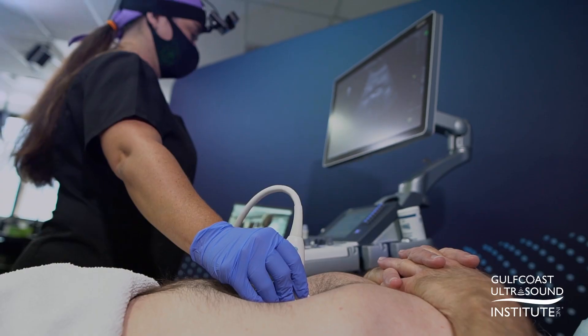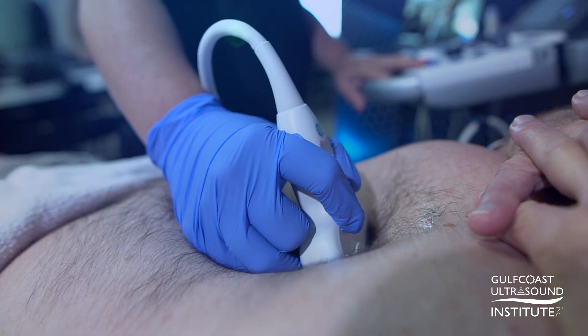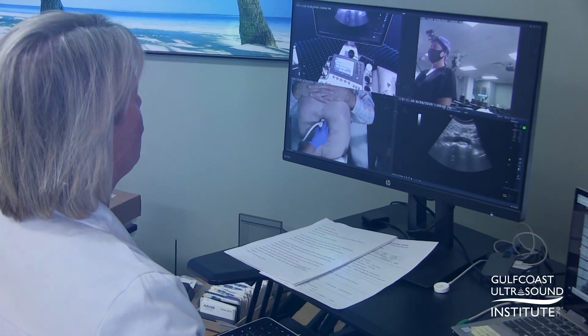The Remote Coach enables you to experience a private hands-on training session with a live model patient. An expert instructor will remotely guide and critique just as if they were standing next to you in the room.